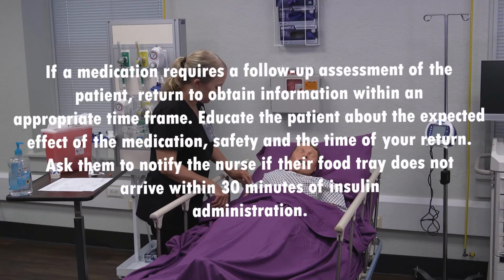If a medication requires a follow-up assessment of the patient, return to obtain information within an appropriate time frame. Educate the patient about the expected effect of the medication, safety, and the time of your return. Ask them to notify the nurse if their food tray does not arrive within 30 minutes of insulin administration.